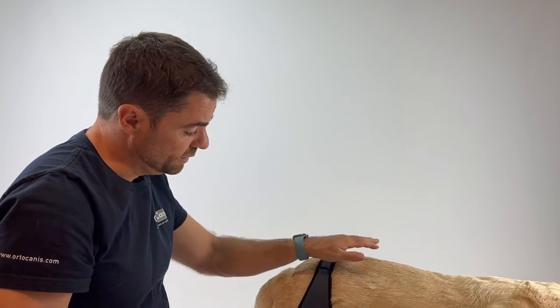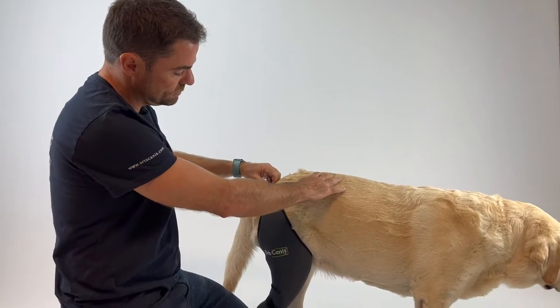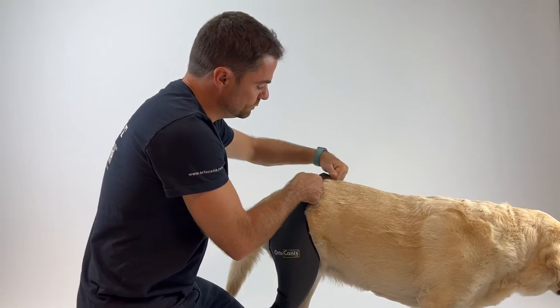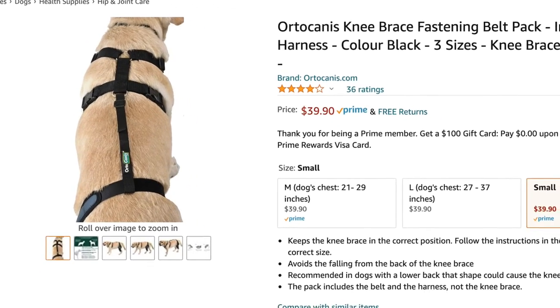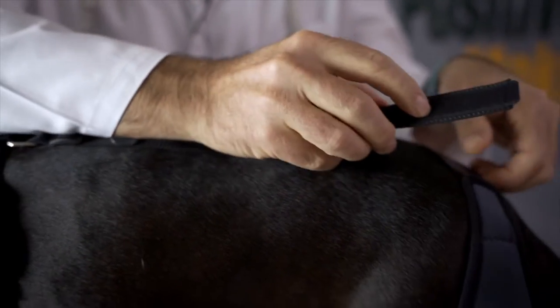If your dog has fallen hips, it may happen that these straps fall down. To avoid that, you would need the Ortokanis fastening belt, which is a harness and a fastening belt that will hold this strap in place.